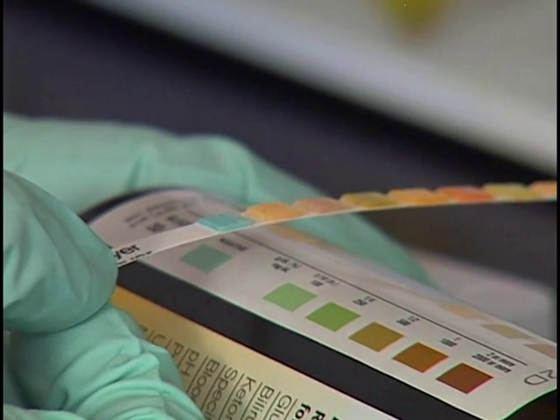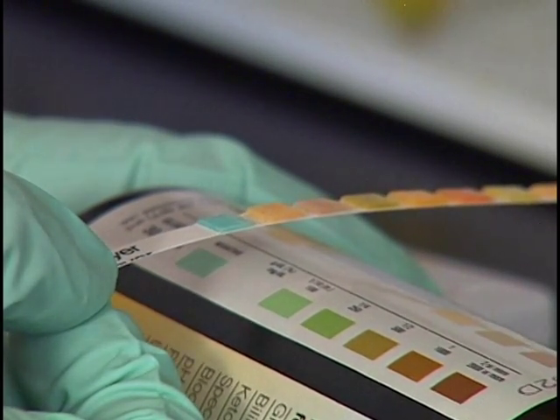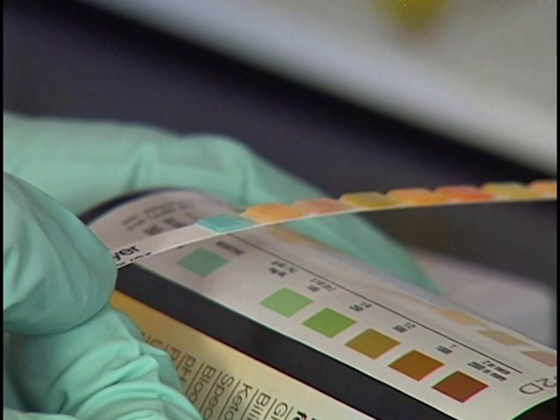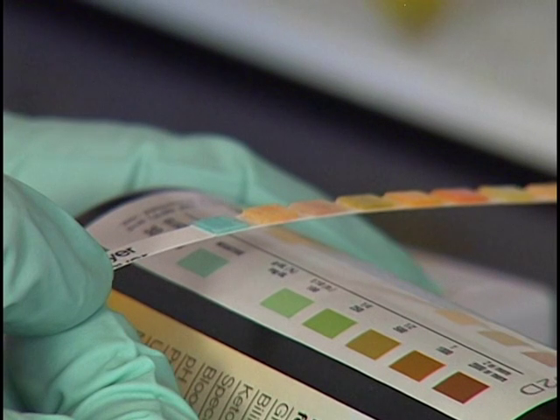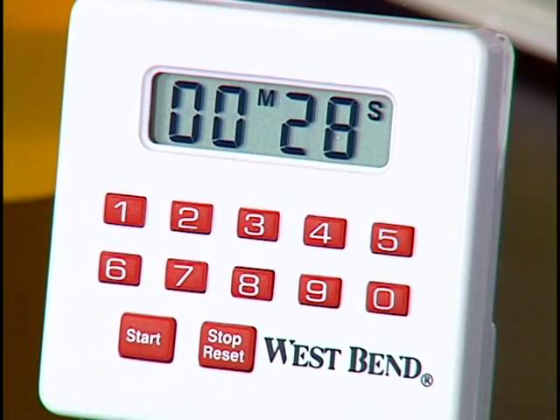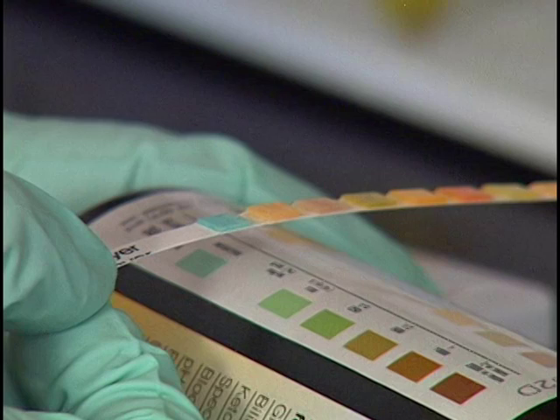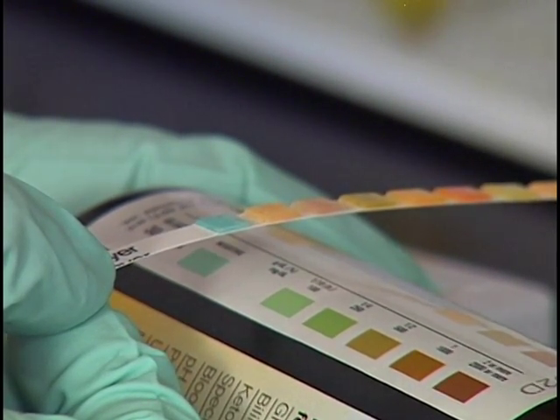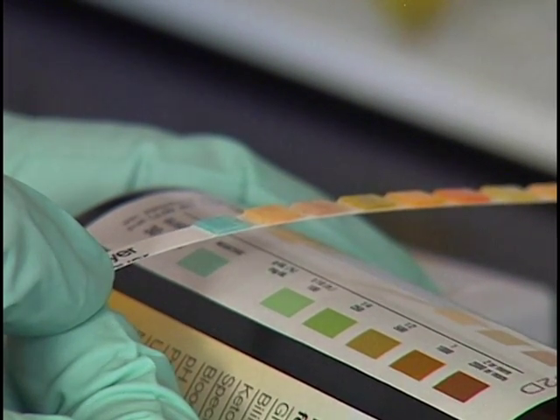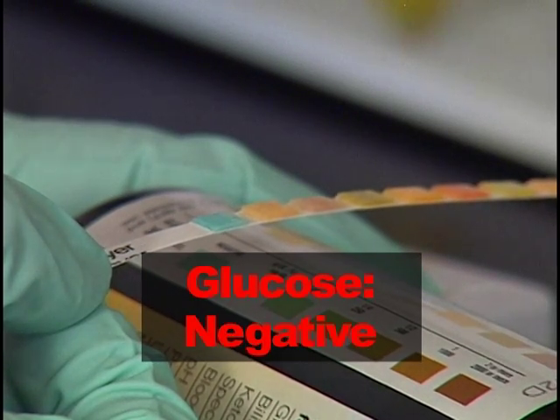Glucose is the first test to be assessed. Place the glucose reagent pad as close as possible to its corresponding row of color blocks on the chart. Do not lay the strip directly on the chart because this would result in the urine soiling the chart. When your timer reaches 30 seconds, carefully match the color of the glucose reagent pad with the appropriate color block in the row of blocks. Look at the interpretation guide provided above each color block on the chart to determine the result. Make a mental note of this result. The glucose result for this test is negative.